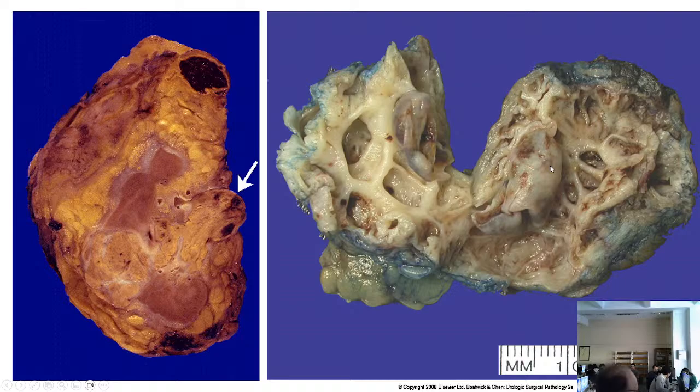So this is not a simple cyst, as we previously saw. This is a carcinoma, or a neoplasm better, because it is of very, very good prognosis, of the multicystic type of a carcinoma. It is a multicystic renal cell neoplasm. You don't call it carcinoma because it is too benign behaving. However, it is a neoplasm, not a cyst, not a simple cyst.